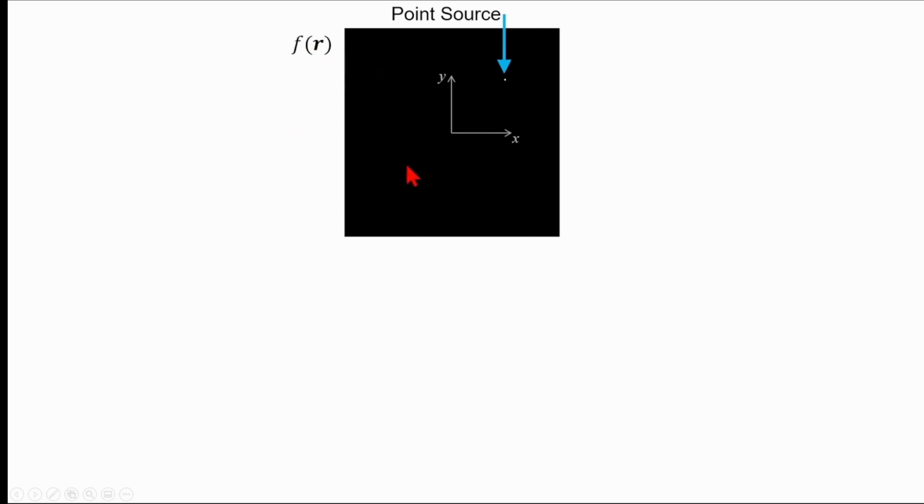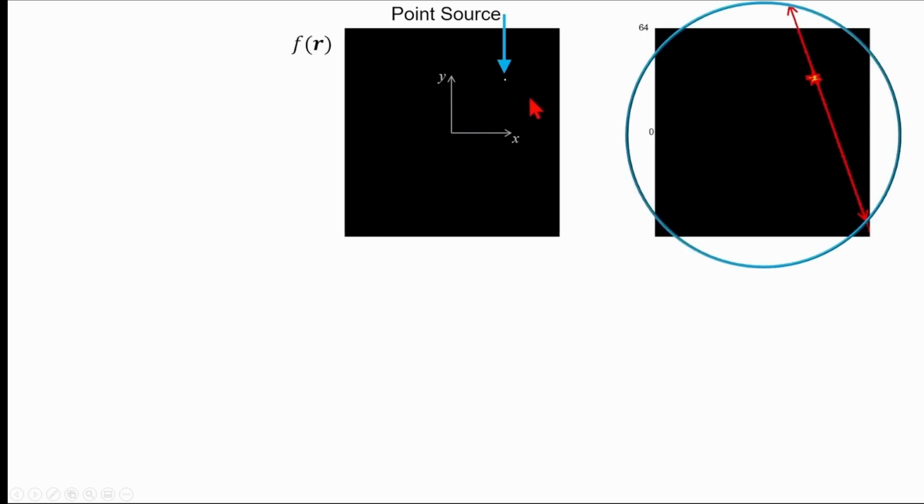So here then is our radio tracer concentration, F of R, and we've just got this point source of activity. Over here, I'm just going to do a copy of this image just to show what's happening here with the emission of two high energy 511 keV photons, and I've got the ring of detectors around that field of view again. And so with a detection, you'll see here I've kind of depicted an annihilation. The positron's emitted, it meets an electron, we get annihilation, two photons, and we're going to assume that they are detected at detector D1, D2.